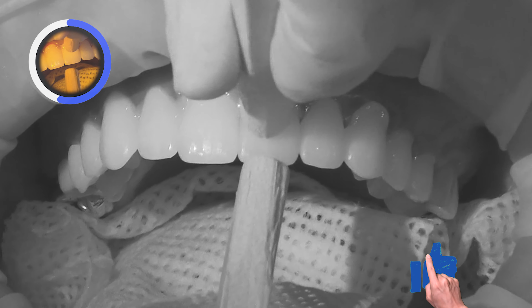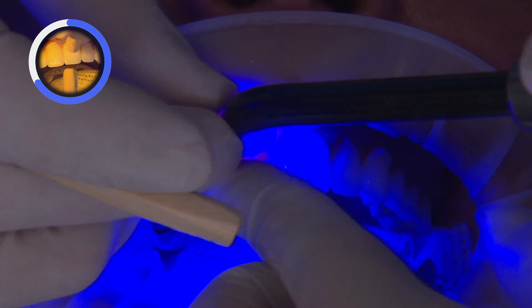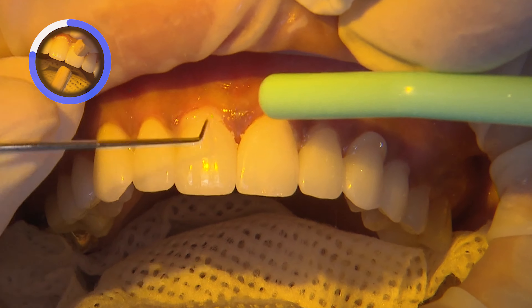Once the restorations have been washed and dried, we then use Monobond Plus, which is an MDP-containing primer — the special coupling agent needed to bond zirconia restorations to resin.